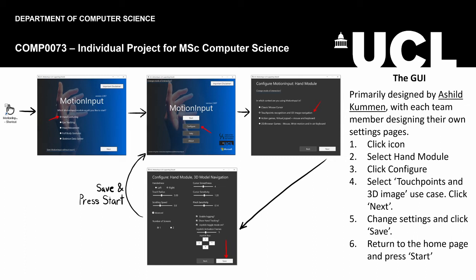Once you select that, click next, and then you just get to the settings page, and you can change the settings as you wish. So for example, in there you can choose whether you're left-handed or right-handed. You can select touch radius for how big you want the touch contacts to be. There's a cursor sensitivity in there as well, which is quite important. If you feel like your cursor is moving a little bit too slowly and you have to reset your hand too much, that can be quite helpful as well. There are key mappings for the joysticks and whether or not you want to enable that toggle mode for the joystick as well. So once you do that, you press save, you go back to the home screen, and you press start to start the backend application.